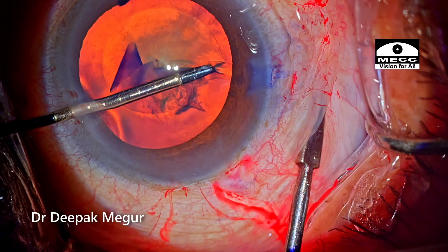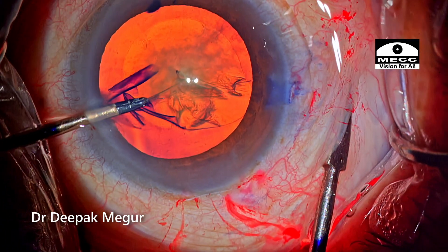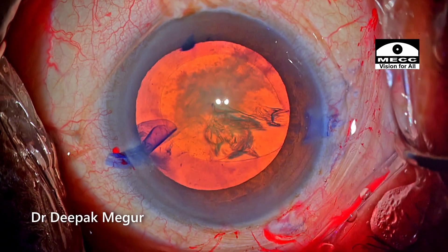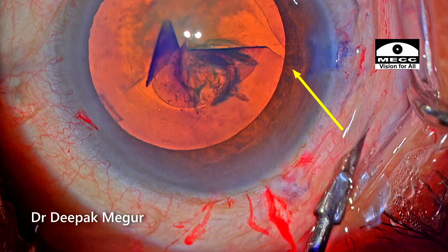This was my first attempt and it came off very well. I'm going to try it on a few more cases whenever such a situation and opportunity arises. Let's re-look at the maneuvers done here. First, I've just depressed the sclera adjacent to the area where the rhexis is heading towards the equator.